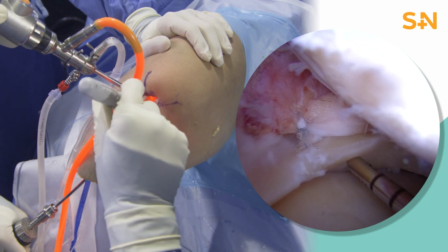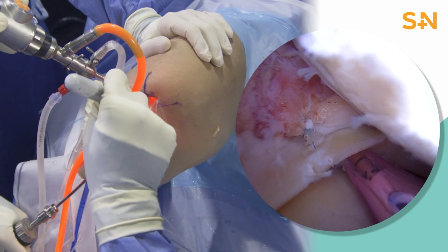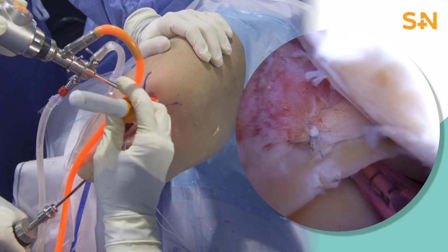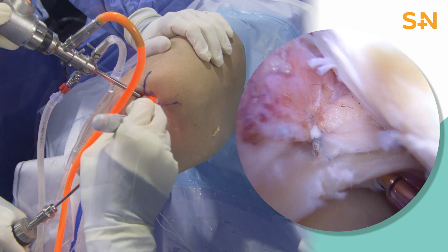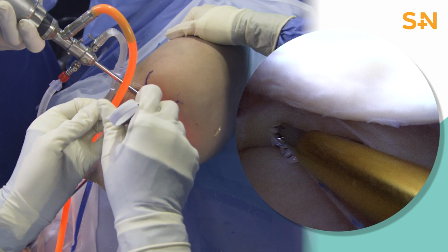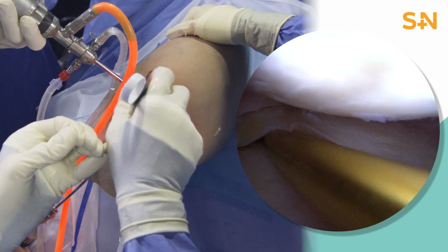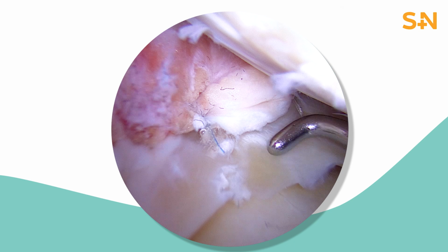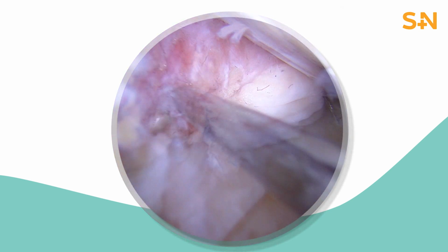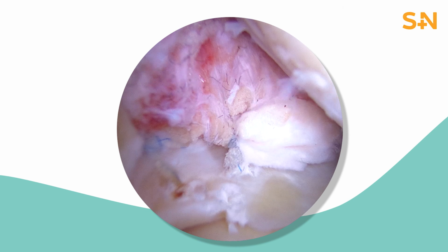To repair undersurface tears and reach for tissue distally on the tibia, a reverse curved device is ideal as it allows to secure the meniscotibial ligament inferiorly. The same process is repeated to deploy the implants until secure fixation is achieved on the tibial side. Final probing of the meniscus demonstrates a secure fixation with anatomical restitution of the meniscocapsular junction.